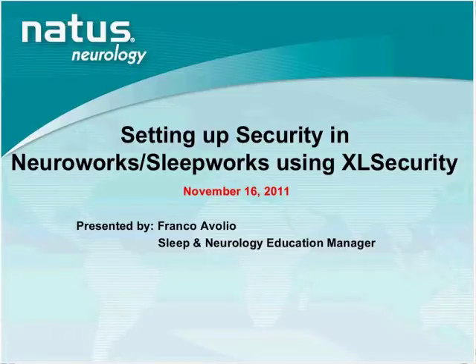Today's presentation is applicable to versions 6.0, 6.1, 6.3 up to 7.0. Today's session is not intended to be a definitive guide or explanation of the security framework in NeuroWorks SleepWorks software. It is intended to provide you with an introduction to the XLSecurity software and what it's designed to address. It's also designed to provide you with some instructions to start using it as well.